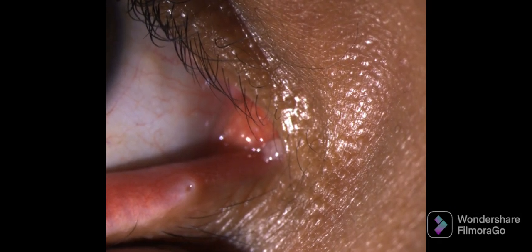The next structure is the medial canthus, which is examined for the lower punctum, which appears as a small pit. As you can see in the video, it is slightly magnified and better appreciable. In the same way, the upper punctum is also examined.